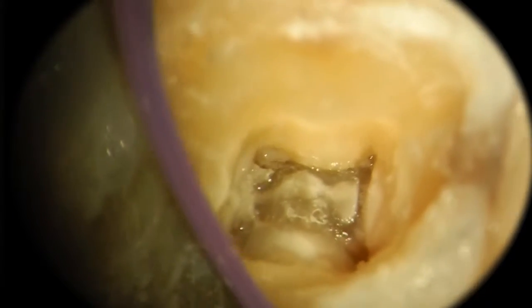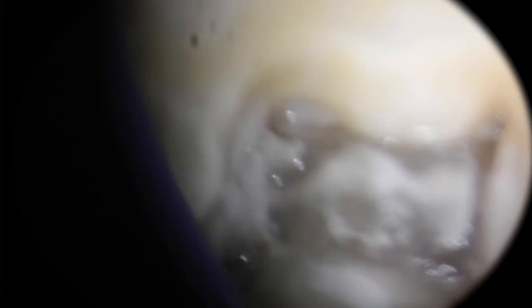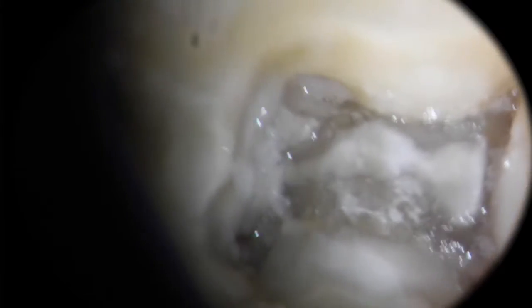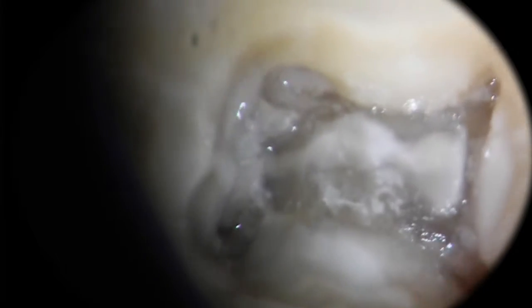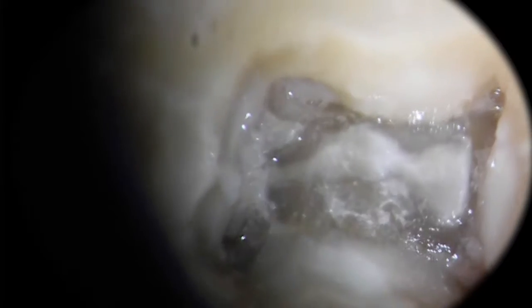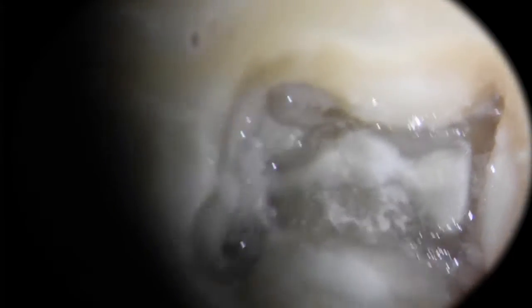And we are at the 1 number, and now we are going to go to 2. Now what I find with this particular microscope is that when we go to 2, the light seems to change, but there we have a good idea as to what the floor of the chamber looks like. And there's still a little bit of tissue there clinging to the floor of the chamber. This was a fairly vital case with an exposure on the distal due to caries.